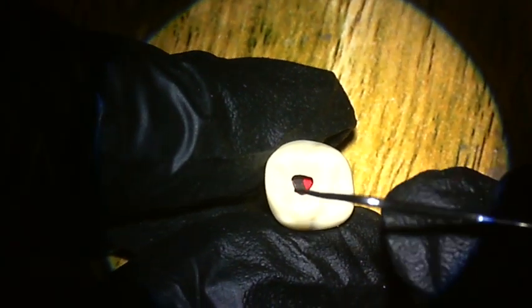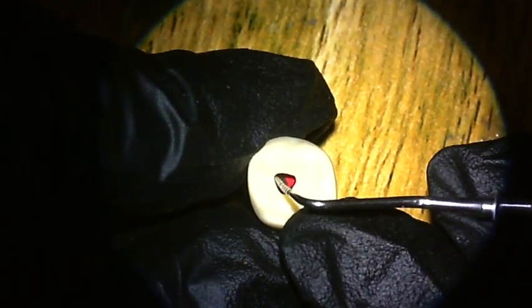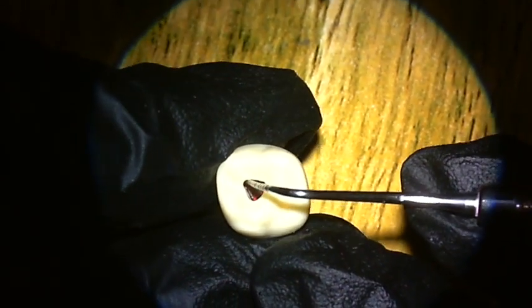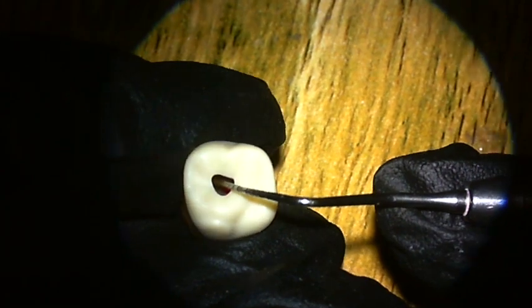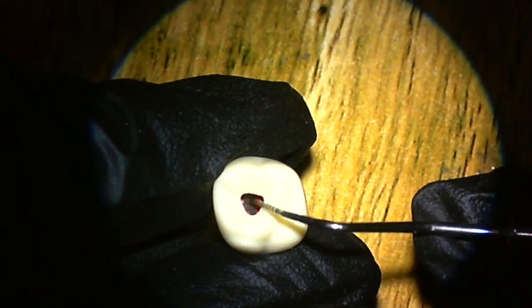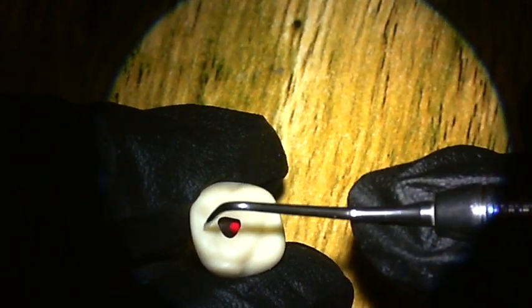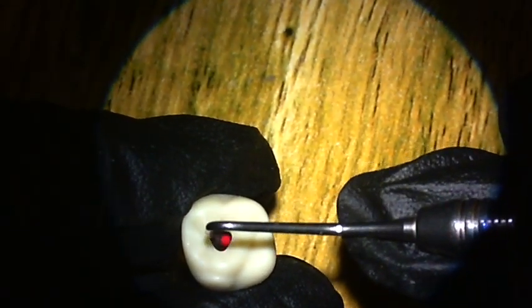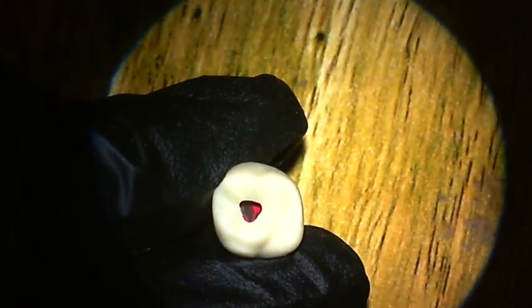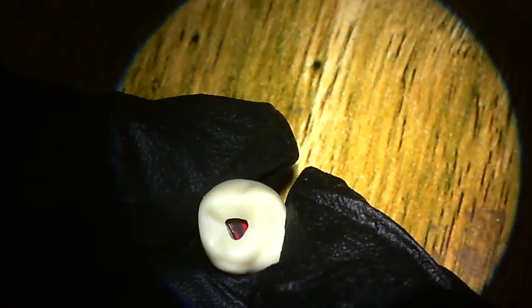If you place the probe to reach a certain canal, for example, the mesiobuccal canal, and you had to tilt the straight probe too much to the distal, approaching from the occlusal view, or if it goes really straight without any angle, it means you are having either an under reduction or over reduction respectively. That's how you know you got an appropriate shape.